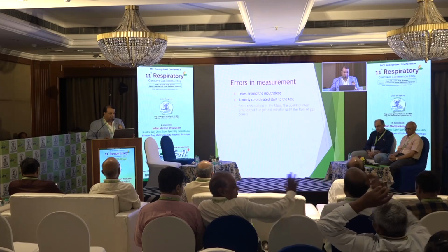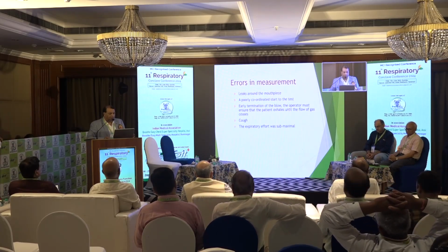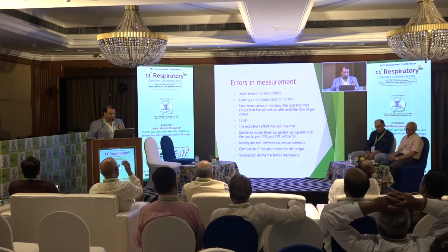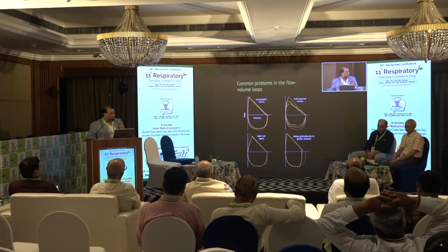Errors in the measurement are commonly a leak around the mouthpiece, a poorly coordinated start of test, early termination of flow, coughing, and submaximal expiratory effort. These are some graphic presentations of common problems in the flow volumes.